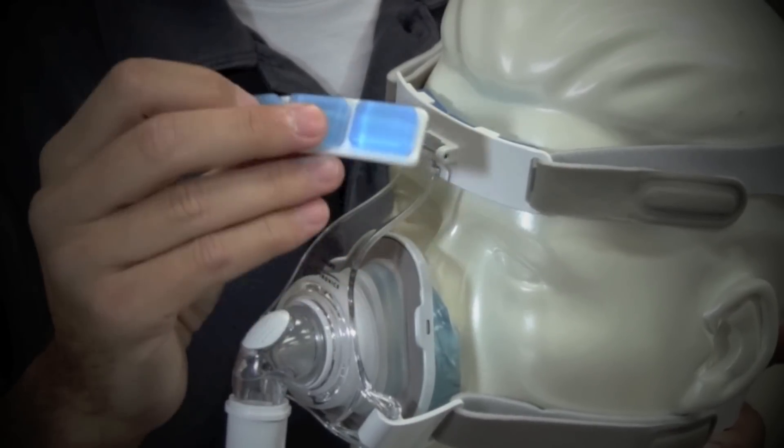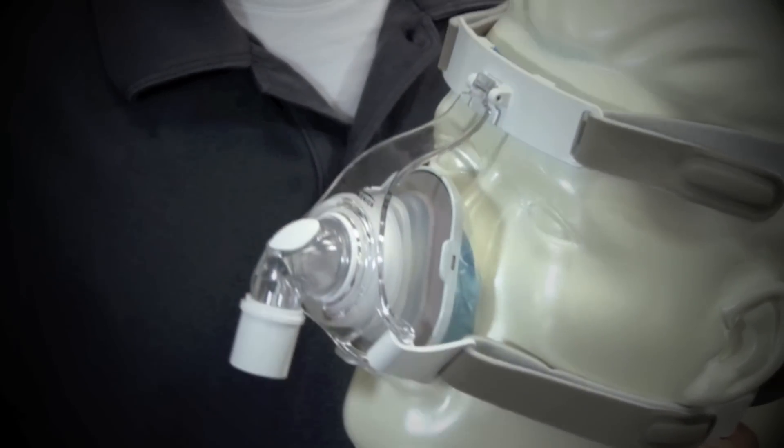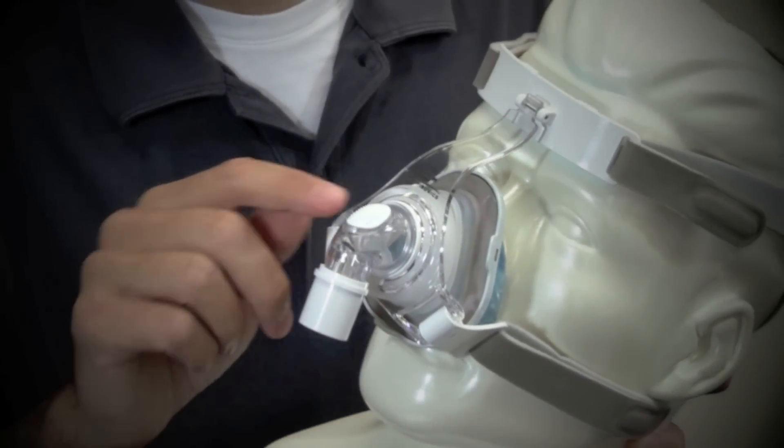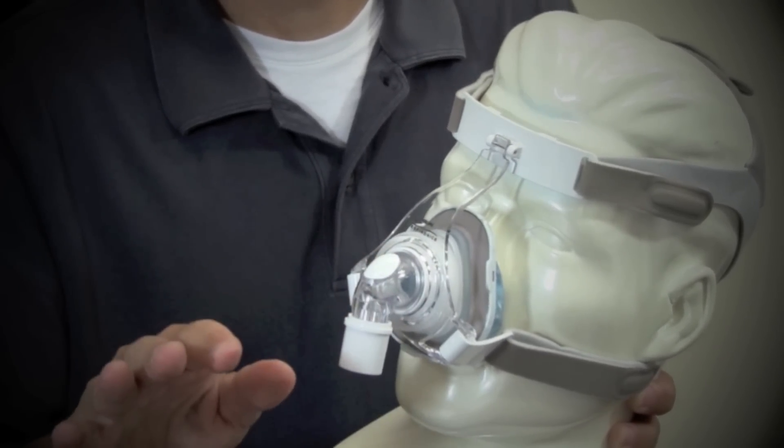Like most CPAP items, this is going to break down after time, but the parts are replaceable. There's an angled exhalation port right here. This makes for a very quiet mask and redirects air away from your bed partner.